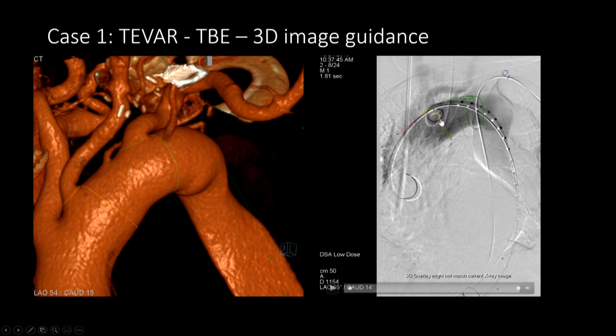And for example, if deformation has happened with the delivery system, you can stop, take a moment, do a quick puff of contrast, and then re-register. This takes hardly 15-20 cc's of contrast. If you didn't do any of these things, you're going in there with a regular LAO 50 or 30, and then shooting a picture. That's not optimal. You change. So you end up easily doing 2 or 3 angiograms before you even start the case.